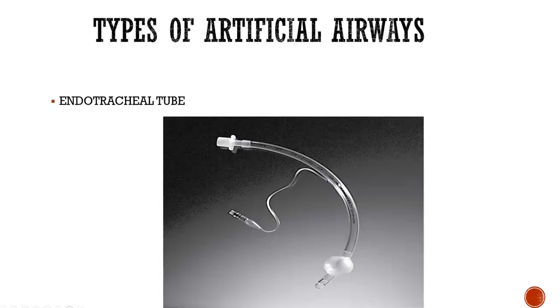And honestly, if your off-going nurse is with you, look at that together, because they're going to be able to probably tell you, oh, hey, that's not in the right spot, that's moved. And if that's the case, you need to get a chest x-ray and make sure that it's still about 2 centimeters above the carina and hasn't either pushed down or pulled up to where you're either going to need a provider to come and push it down a little bit, or a respiratory therapist to push it down a little bit, or pull it back. Because too far up or too far down are going to be problematic either way.